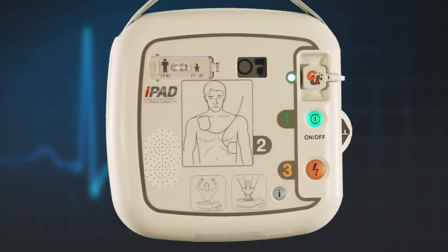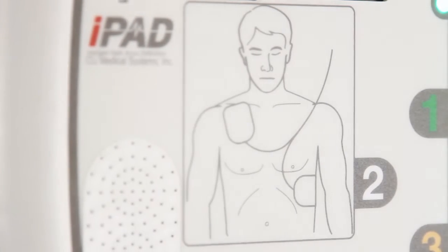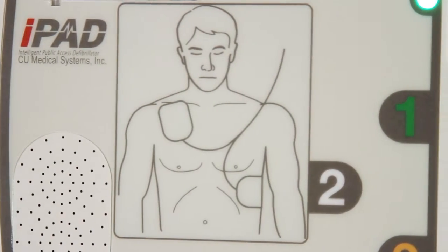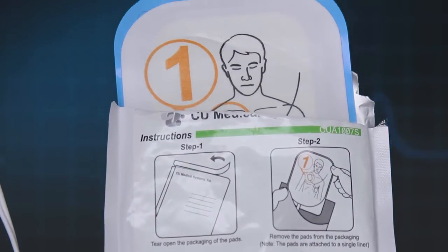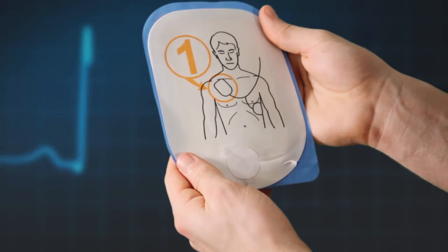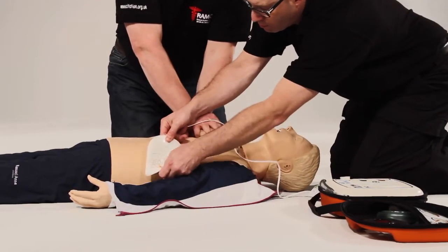The AED will then give you visual and audible prompts on what to do. Follow these instructions. The AED will prompt you to remove the pads and place the pads as shown on the pictures. Should you place the pads at a pace faster than the voice prompts, the iPad SP1 AED will catch up with you.